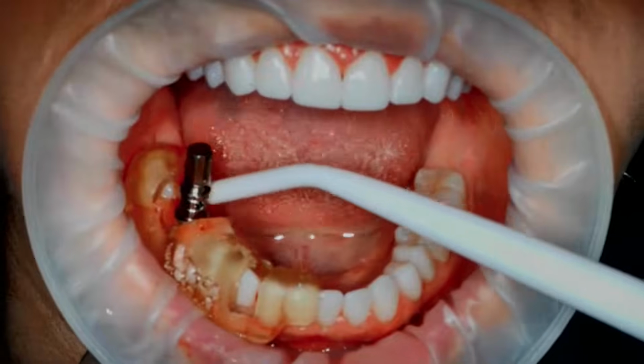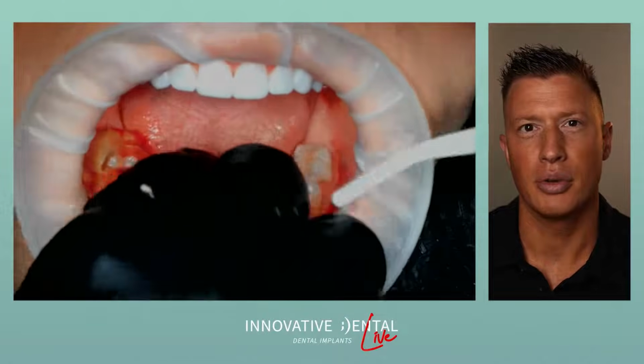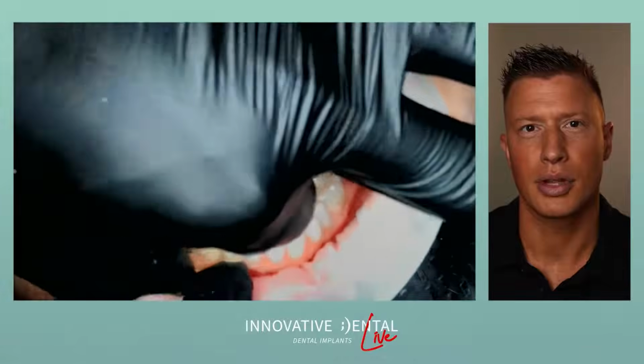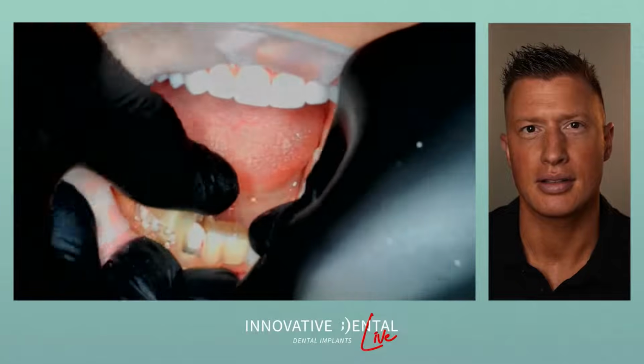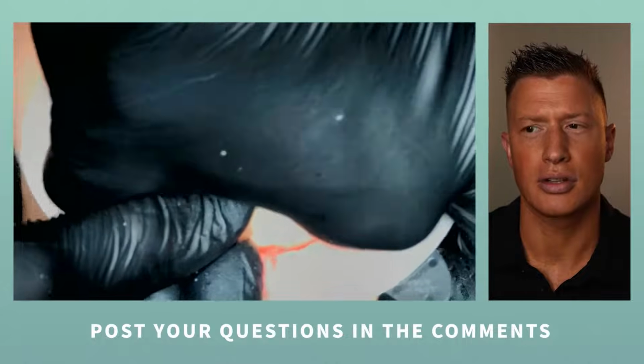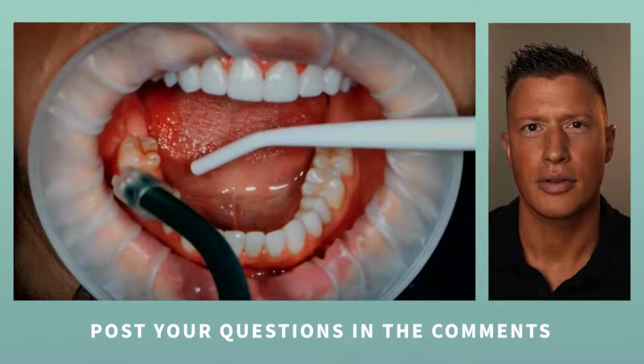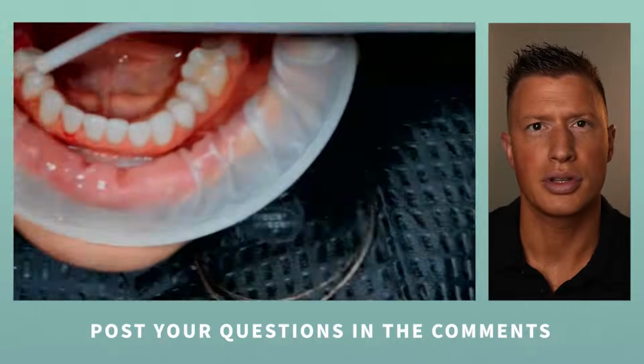We're done. Got the implant in place, right depth. Go ahead and take out the implant mount. We can remove our implant guide. Total time here, we're probably somewhere around 8 minutes, 8 to 10. Guides fit pretty tight, so you'll notice I have to kind of wiggle it a little bit, but there we are. So now we've got the site, and I'll use a mirror here so you can really see it.